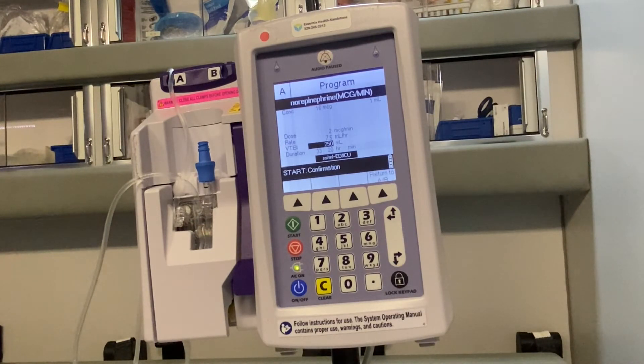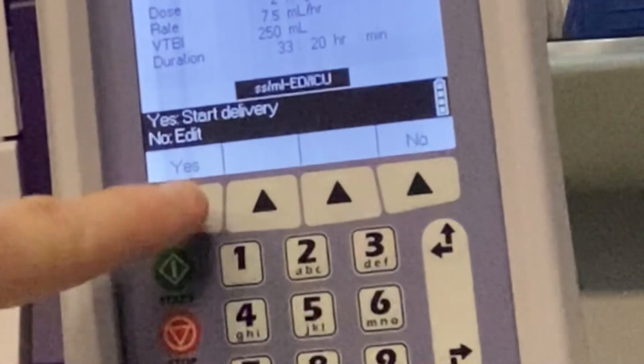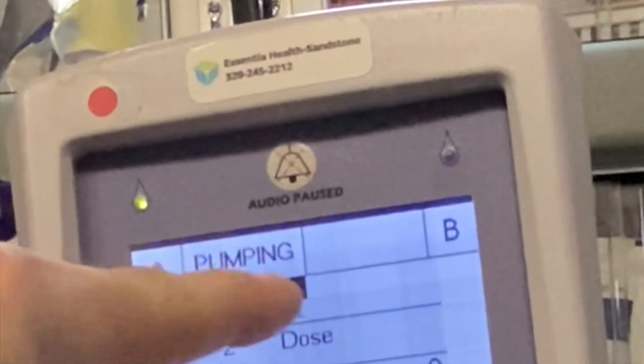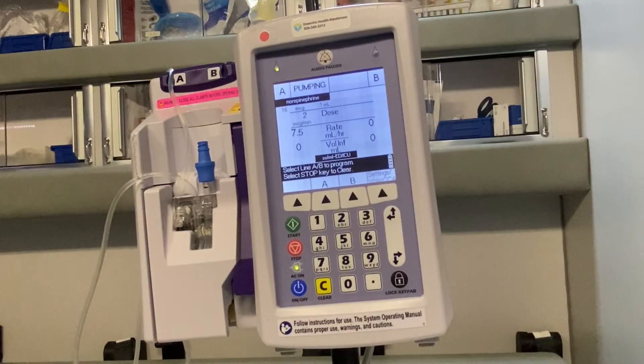You may want to choose 50 or 100 milliliters, whatever suits the situation. After that's selected, we want to hit start to confirm. We say yes for start delivery. You can see it's pumping because it says 'pumping' here, and this little drop shows a flashing green light. If you listen carefully, you can also hear almost like the secondhand of a clock ticking — that's the pump of each drip.